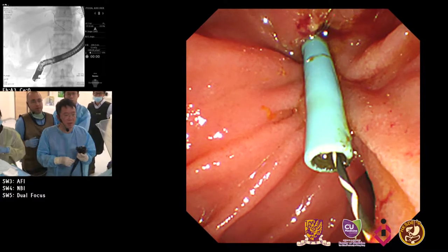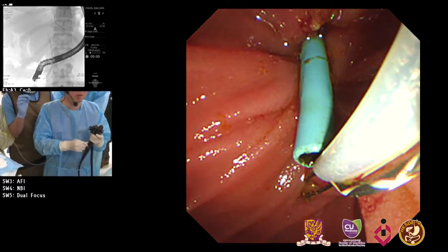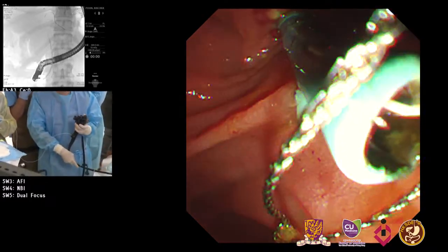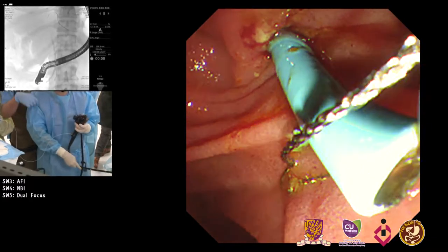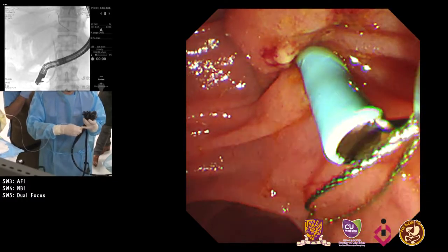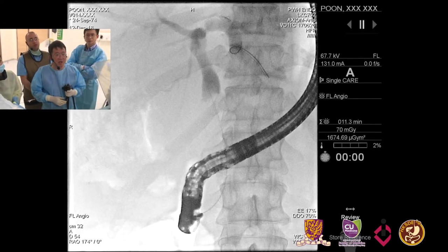You are out. Okay, so open small. Open. Small. A little more. That's it. A little more. Okay, that's it. So with a large wheel, if you can push the stent, the snare out a little more, until you see the white sheath on the stent. Okay, a little bit open. Back. Okay. We take out the stent with the snare guide wire method.